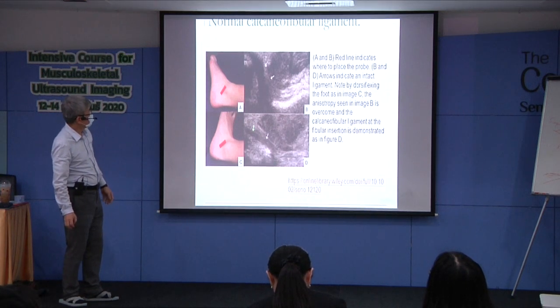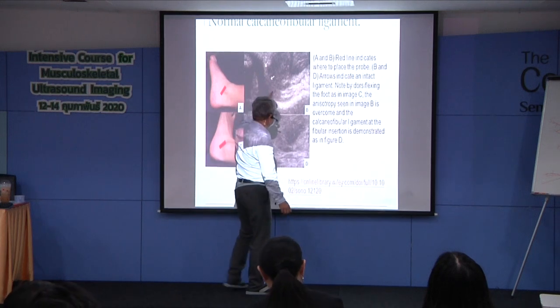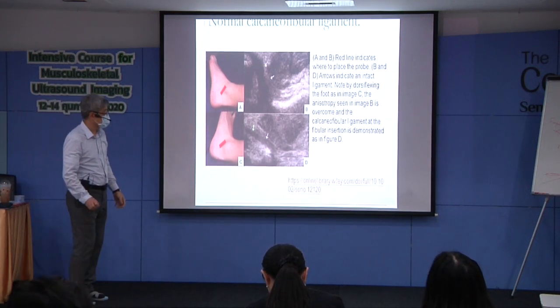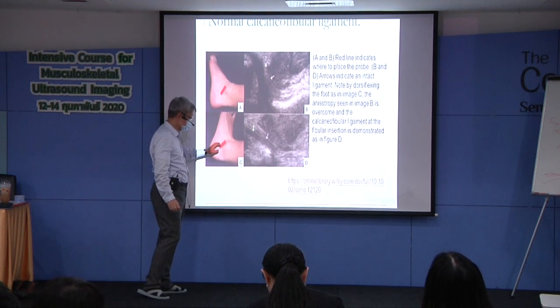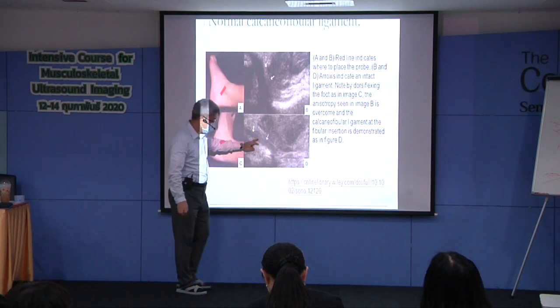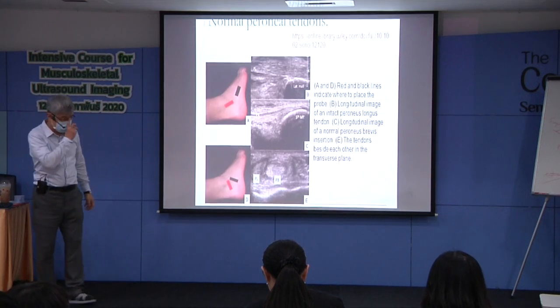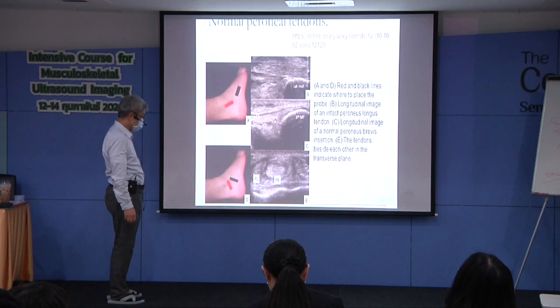Okay, this is CF. It's a very bright ligament, very bright. So you should be able to see it in the ultrasound, and you can use different postures to make the ligament more visible. But you need a very good machine, because this tiny and superficial ligament is not easy to look at without a high resolution ultrasound.